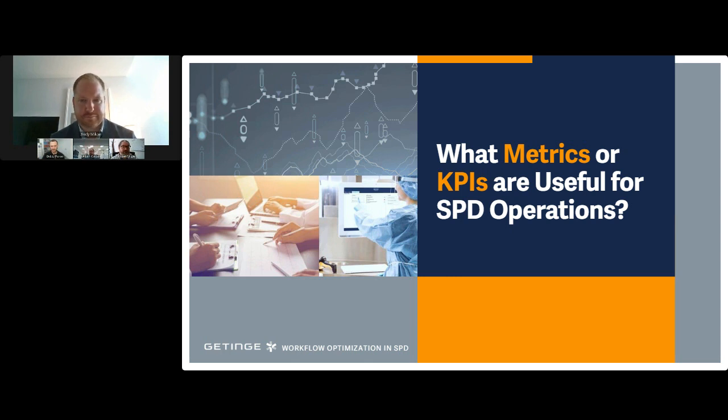So you need to select some sort of device. There's multitudes of things, whether it's protein test, residual test, ATP, whatever your preference of choice is. You want to be able to make sure that you are actually verifying that your processes are truly working. And that's just an example for decon. That's pretty much at every stage of the game.